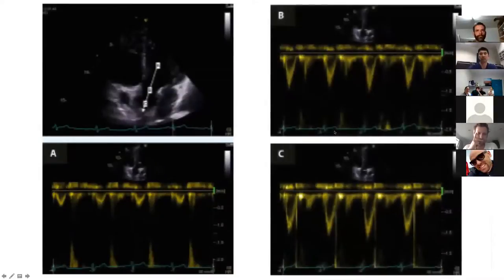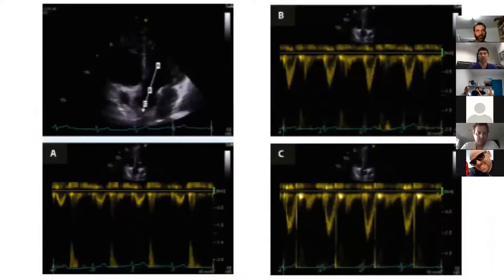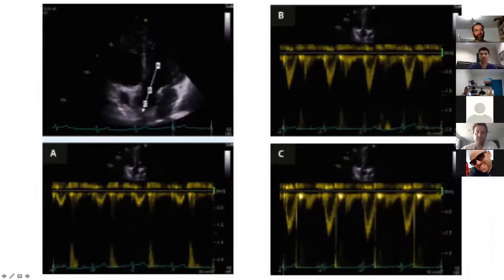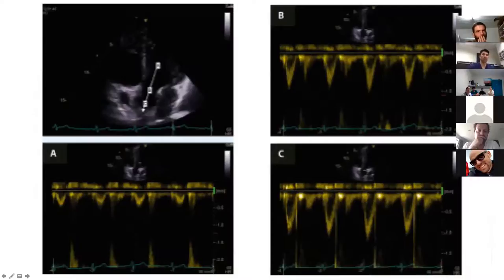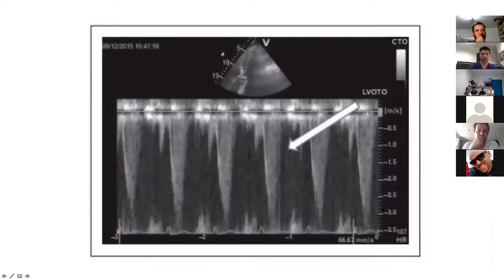This demonstrates the process of hunting for a dynamic obstruction. You start quite deep within the LV cavity so you don't miss anything. Panel A is deep in the cavity, panel B is mid-level, and panel C is right at the LVOT — showing what a normal trace should look like at each level.